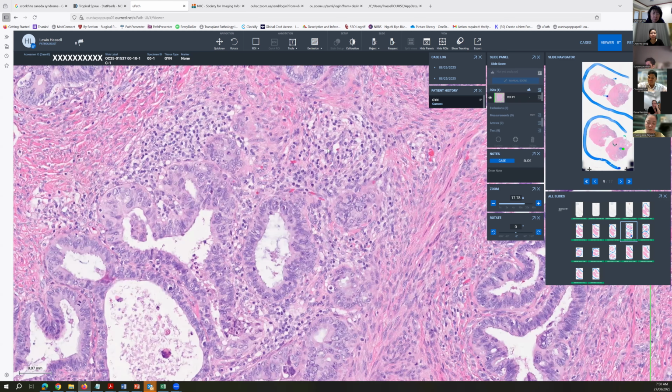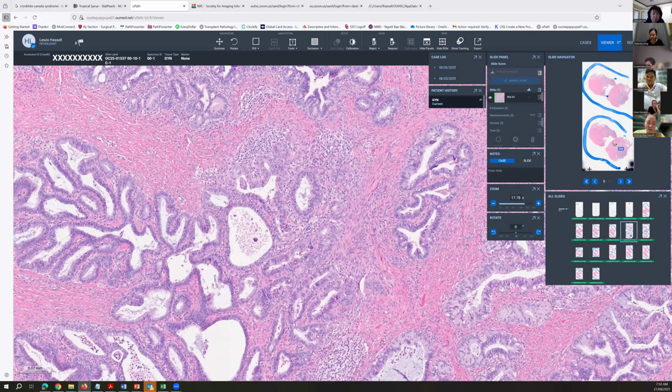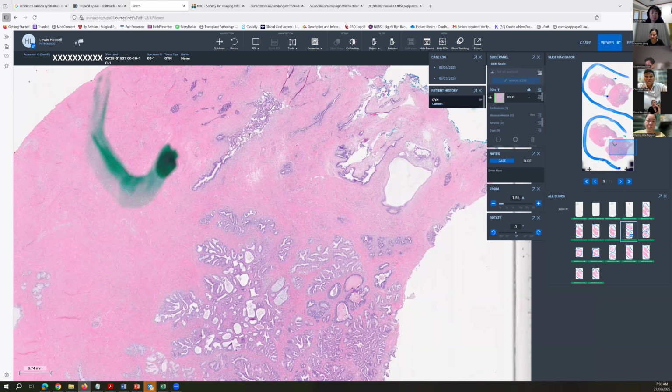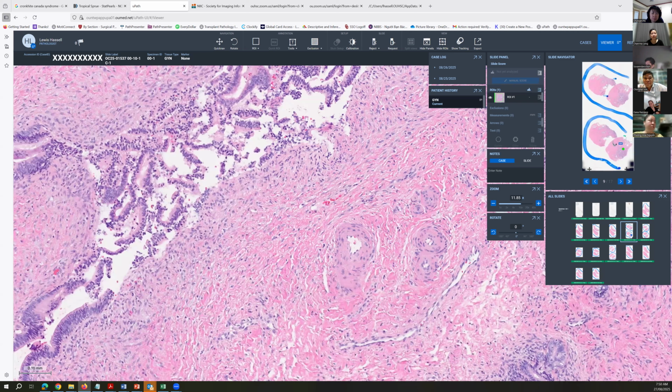And then C pattern invasion is where that type of reaction is the dominant feature of the lesion. So in this case, there were just very minimal areas which could be stromal reactive change, a little bit of that around here. Potentially, this is a little bit of that type of change, because you see the gland is fragmented and there's a little bit of stromal reaction around there.